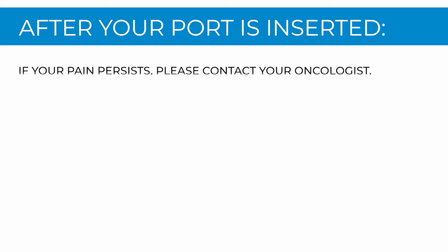In this video, I want to explain what to expect immediately after a port is inserted by your surgeon. During the first 24 to 48 hours after surgery, the incision area will be tender and a little red. Most people don't need pain medications, and the discomfort usually goes away within 48 hours. If your pain persists, please contact your oncologist.